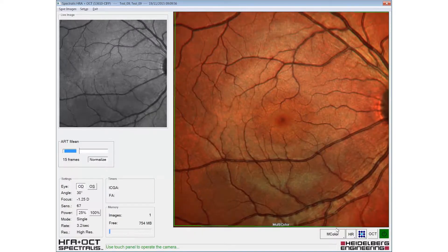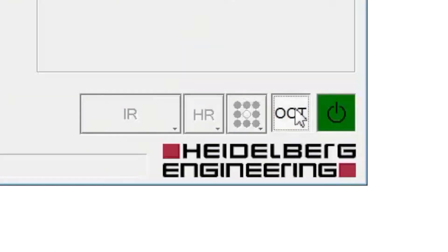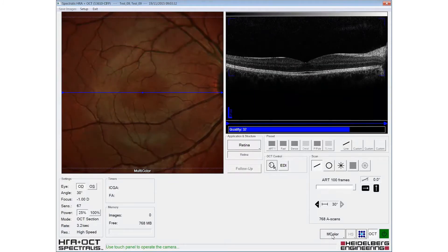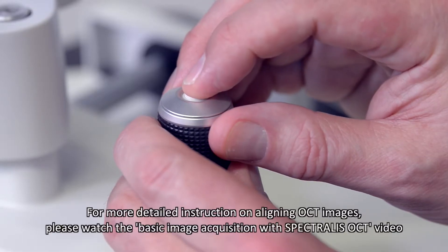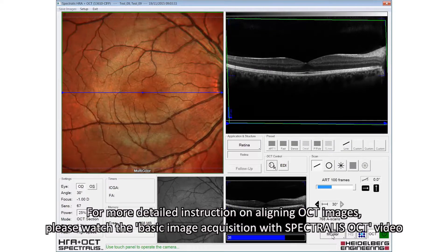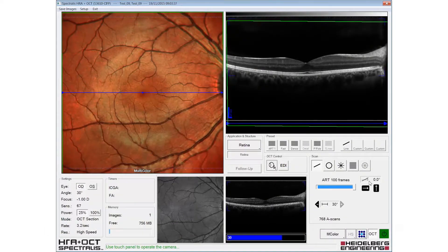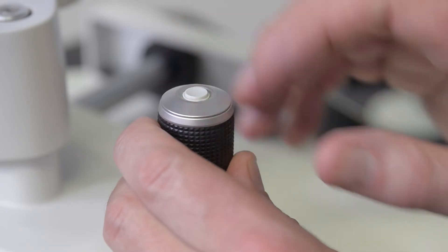A simultaneous multicolour and OCT scan can be acquired by selecting the OCT mode. The eye tracking and automatic real-time is engaged with a long press of the joystick button, and a short button press acquires the image.